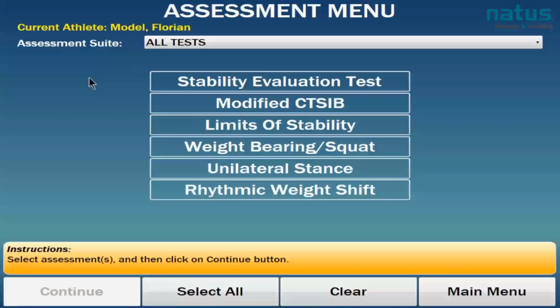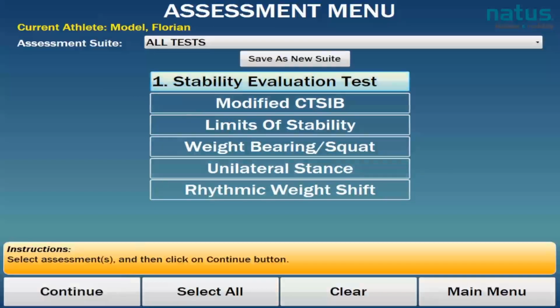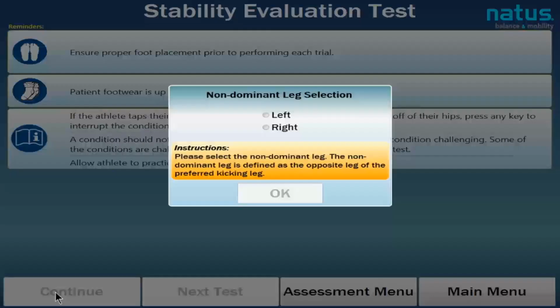We are now ready to perform the SET protocol, the stability evaluation test. I have my patient pulled up in the system. From the assessment menu, I'm going to click on Stability Evaluation Test, and then continue. You'll notice that some important instructions appear on the screen. It's always critical to read all of the instructions on the screen before performing any of the tests.